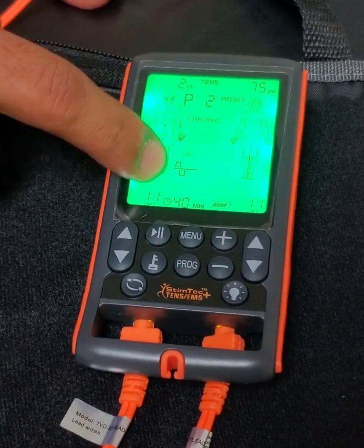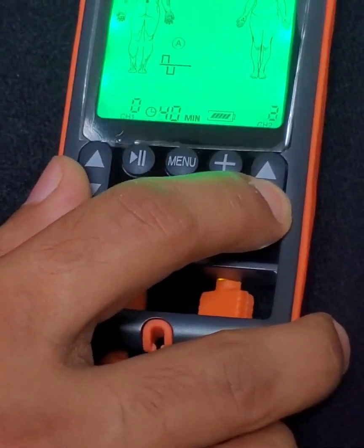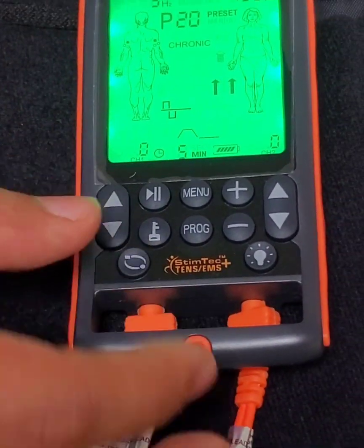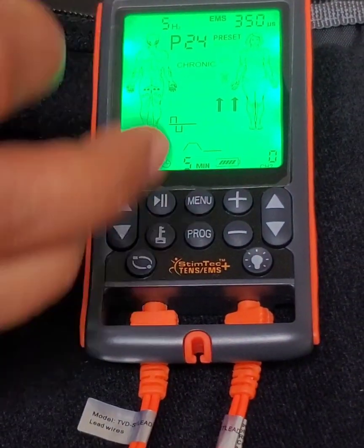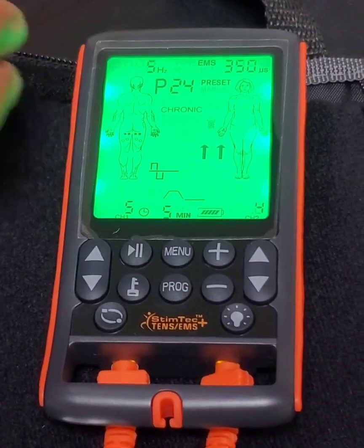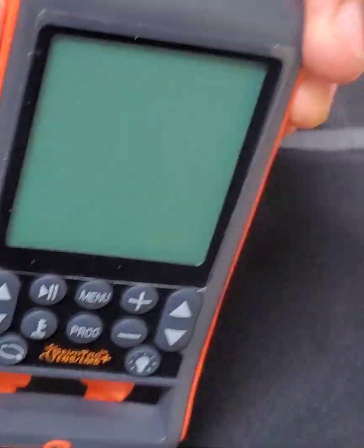If you want to change from TENS to EMS, you have to bring the intensity down to zero first — pretty much turn it off. Once it's completely off, you can hit the program button to change it to EMS. Same thing for EMS — for example if you want to do your calf muscles or hamstrings, put the pads based on how the picture shows in the book, turn it up, and the timing is already set. Leave it for the recommended time, and once the time is up it turns off on its own, or you can pause it and turn it off yourself by hitting the power button.